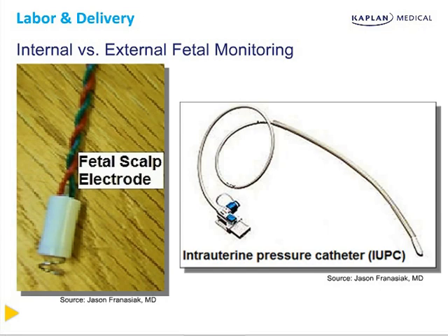The external monitors cannot provide anything more than relative timing of contractions. They don't actually measure pressure inside the uterus. This can be important during protracted labor courses. We would expect normal progression with contractions which generate Montevideo units greater than 200.